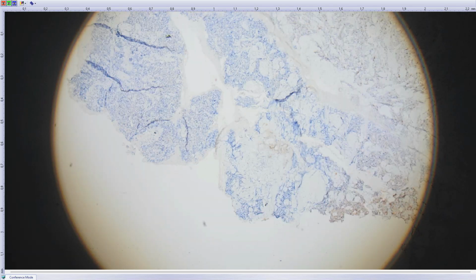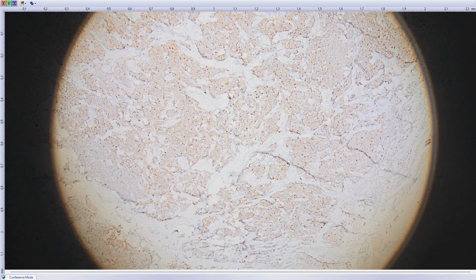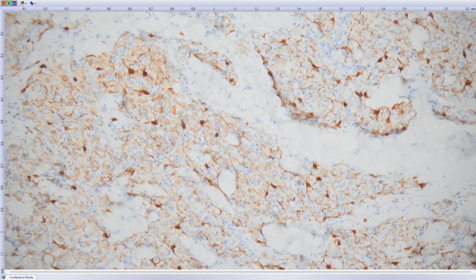and if you wish to have textbook immunohistochemistry, you can perform S100 protein or SOX10 immunohistochemistry, which will show you this peculiar pattern of so-called sustentacular cells present there, and the diagnosis is extra-adrenal paraganglioma.